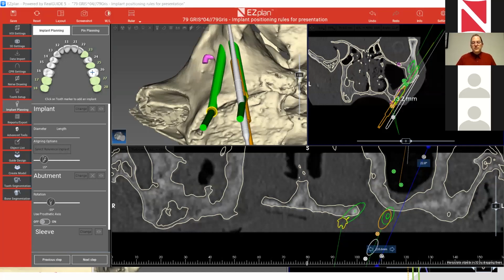And you've seen how complicated finding all those angles is. Even with your experience and many cases done, sometimes things don't go as expected. And we should all remember that zygomatic implants are actually the last chance for this patient, because we will not put a zygomatic implant if we can do anything else. So we don't want to fail.